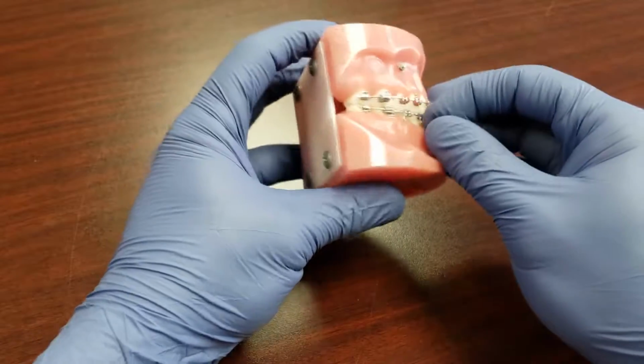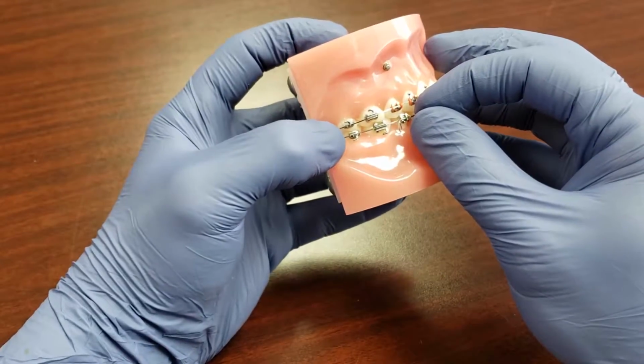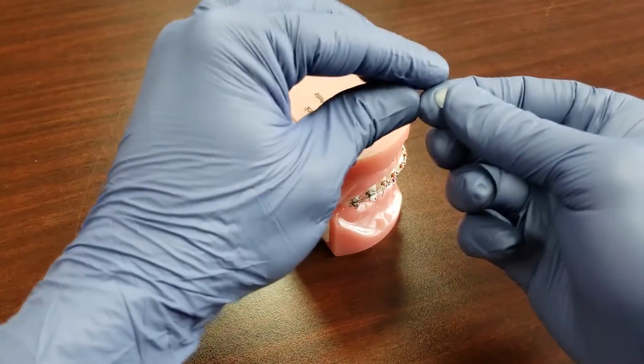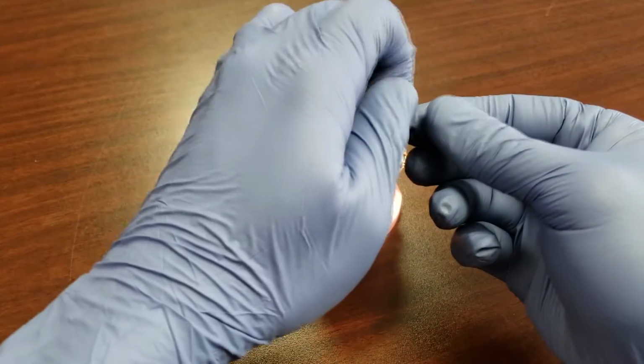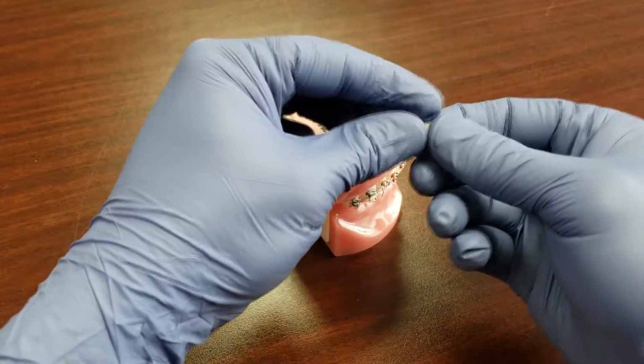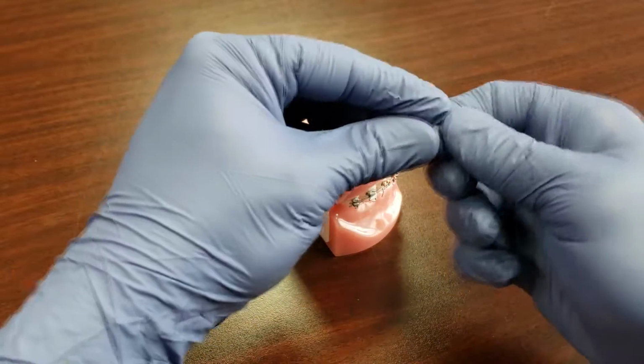So probably one of the most common things that we see is a wire sticking out the back. So something like this. What you first got to do is get that moisture out of the way. So if you're real slobbery, just kind of go like that, swallow that spit, get it out of the way, because that spit is going to keep the wax from sticking.